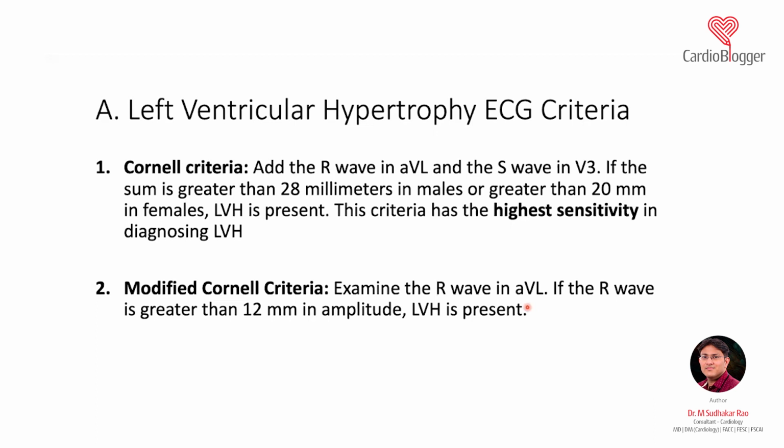So you cannot tell just by this thinking which is more severe, RVH or LVH. It depends on the disease which is causing RVH and LVH. Just by ECG, if you tell which is more severe, RVH or LVH, I think it's not sufficient to answer this question, because it depends on the disease which is producing this RVH or LVH. Right?